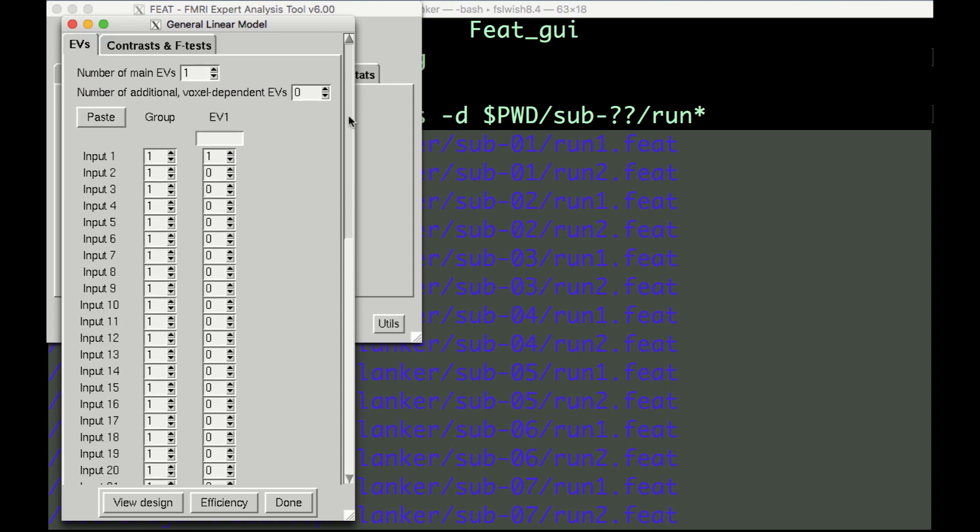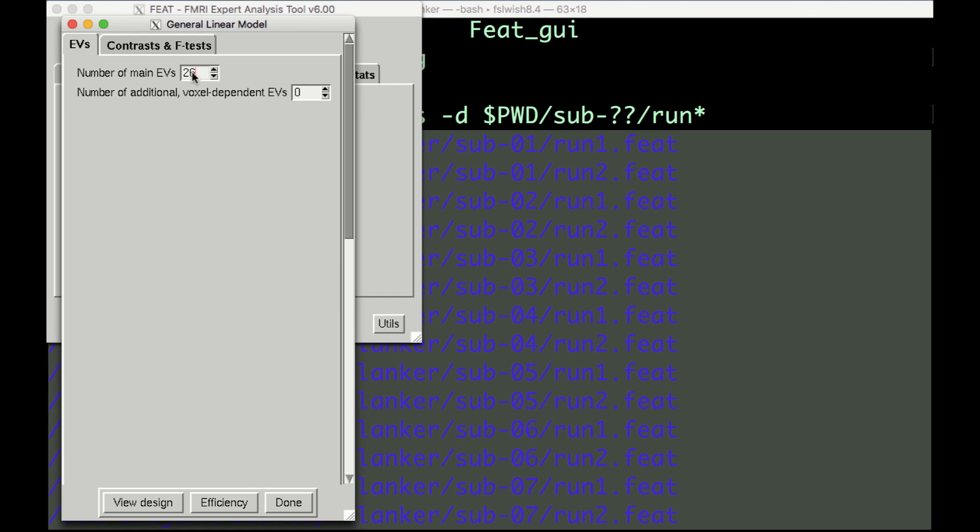For the number of main EVs, change this to 26, which is the number of subjects in our data set, and then press Enter. It may take a while to redraw the window.